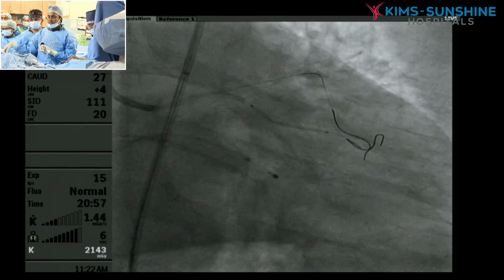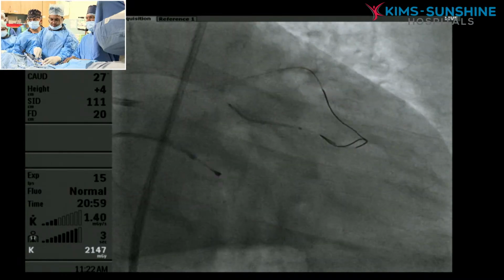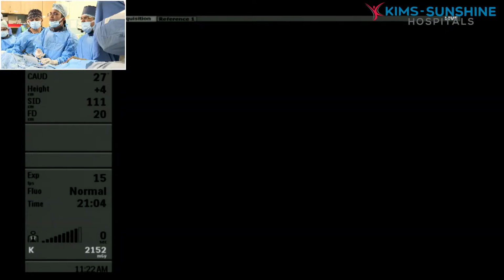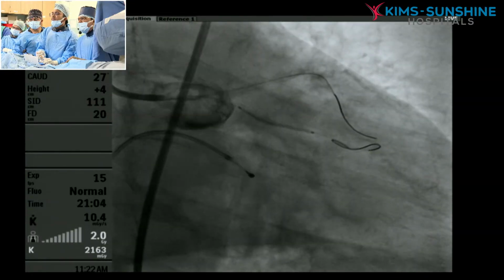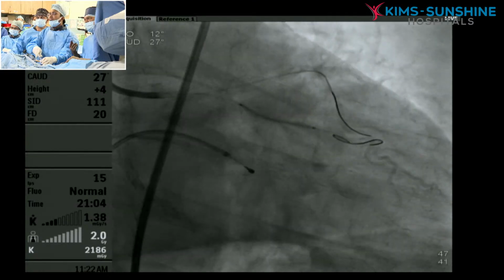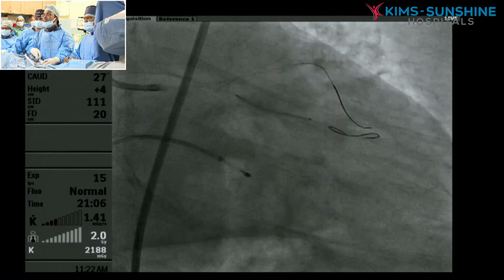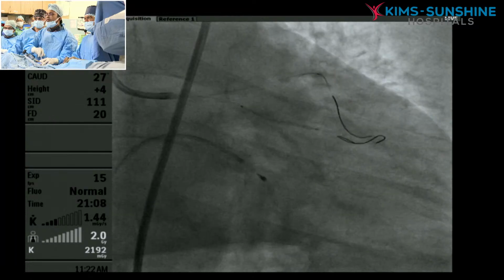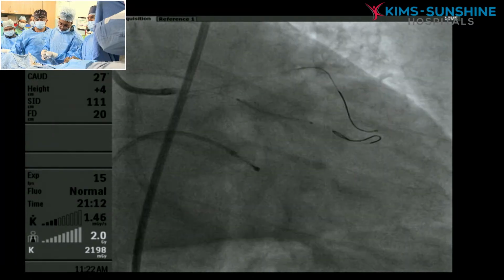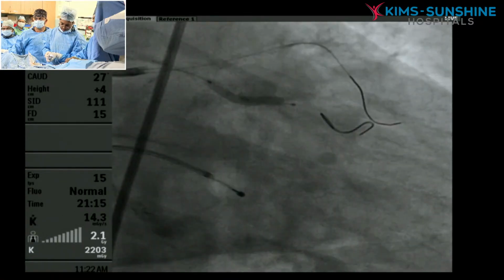That's fine, I think. I'm coming out. Guideliner. Ready. Small injection. Ready? I think there is a small branch. If you want, you can slightly pull also. Keep doing a small test. Go ahead. Right, do it. Deflate.